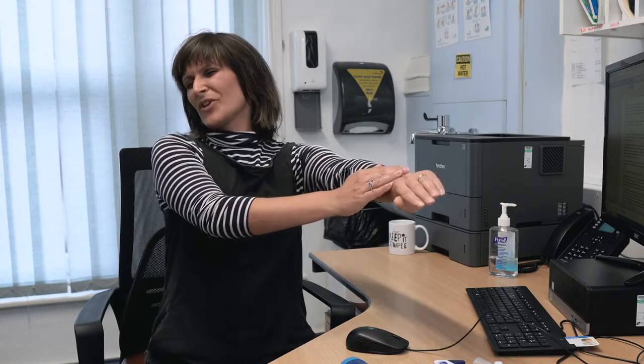If we have poor inhaler technique, what can often happen is an aerosol or a powder can end up in our throat or in our mouth and we swallow it rather than it ending up down in our lungs. So this is akin to popping some cream on your hand, closing your eyes, holding your arm out and slapping the cream on your arm without knowing that it's ended up in the right place. The likelihood is that the cream isn't going to be in the right place and the eczema isn't going to be treated. That's exactly what's happening when we're using an inhaler that isn't being used correctly and we're just hoping for the best.